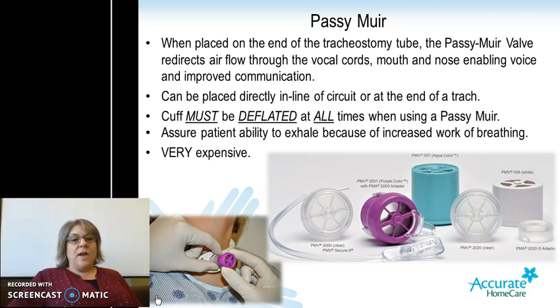Passy-Muir valves also help with muscle strengthening and can help with weaning and getting the person to be able to breathe through their upper airway when maybe they haven't taken a breath for a long time or at all through that upper airway, and their brain has to be retrained to use that again.